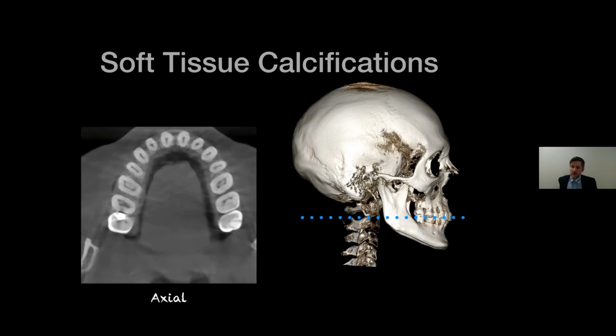Someone asked, can cone beam be used for diagnosing caries? For incipient lesions, I would say the best way to view caries would still be bite wings. But there have been a few studies that have shown that cone beam does show cavitated lesions better than some traditional bite wings. For incipients, though, I would not use cone beam to view incipient lesions.